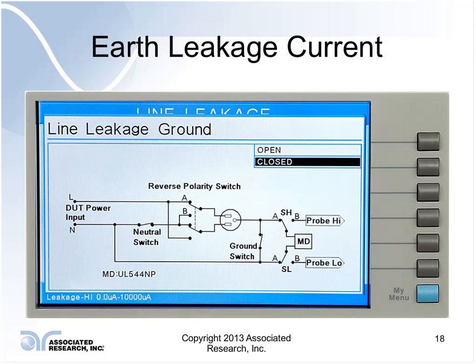So here we have it set up for what we call an earth leakage test, and we can see here's our measuring device here, and we're placing our measuring device, as you can see here, between the ground and one of our mains conductors.